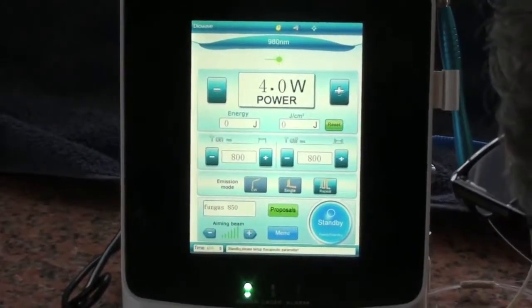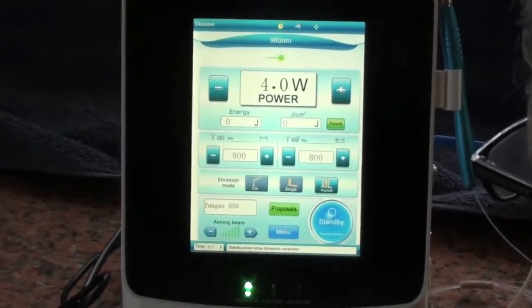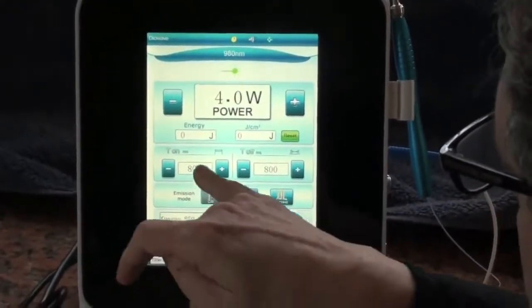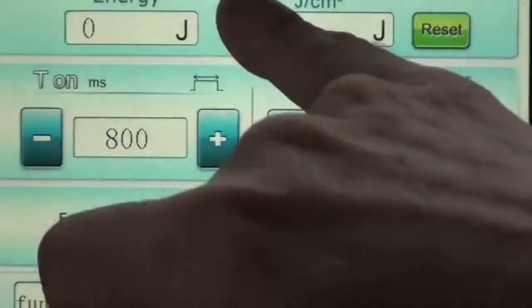Right now it's in standby mode. It's set for one of our protocols, the fungus toenails: 800 on. That's time on or pulse width, 800 off at four watts.